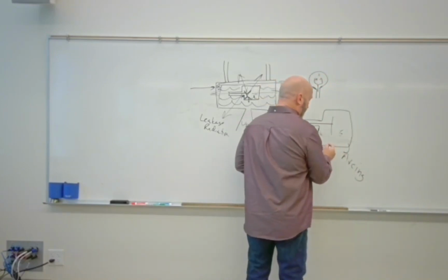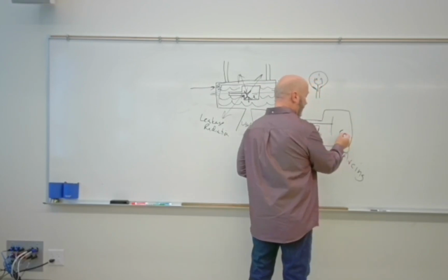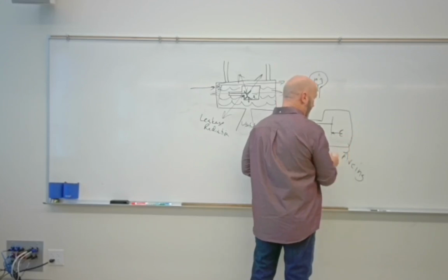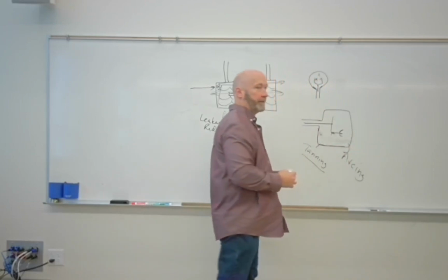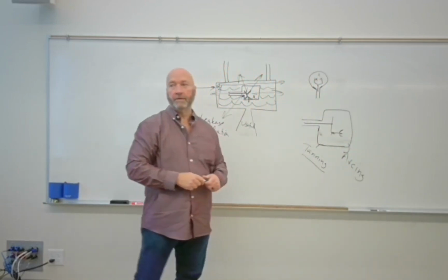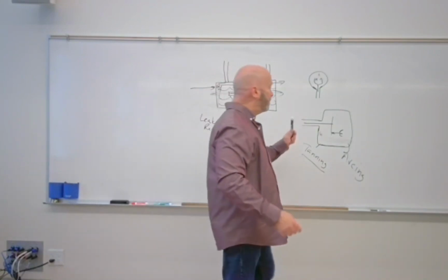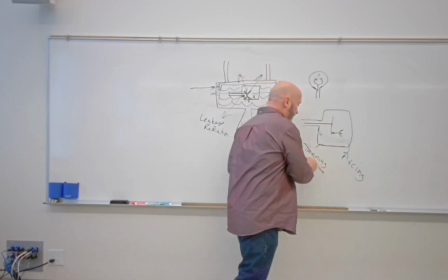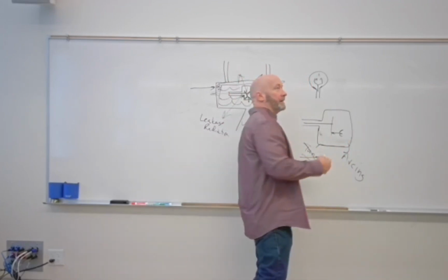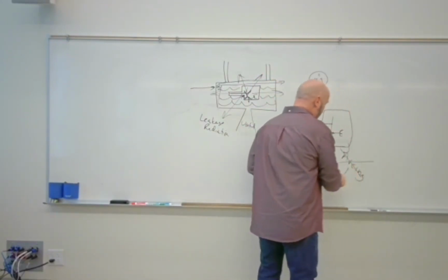But if they make that distance a little bit further and this whole thing is metal and they can build this envelope to where the flow of electrons ignores that metal down there, is laying down another thin layer of metal really going to affect it all that much? No. Answer is no. So the benefit of a metal envelope is that it removes the possibility of tanning. Well, it doesn't remove the possibility of tanning. Tanning's still going to happen. It's going to remove the possibility of arcing due to tanning.